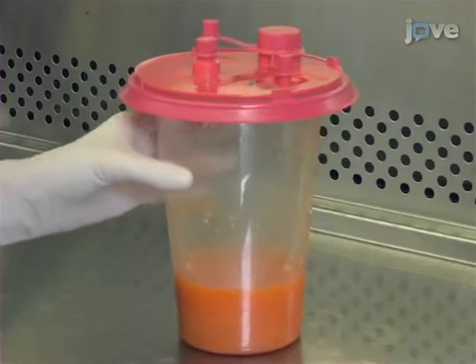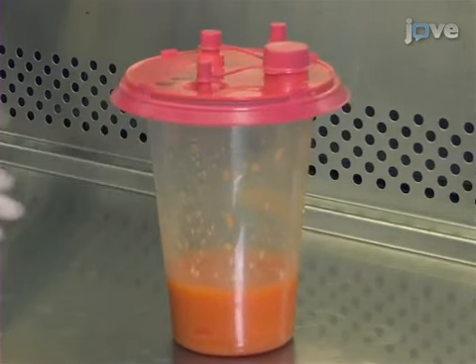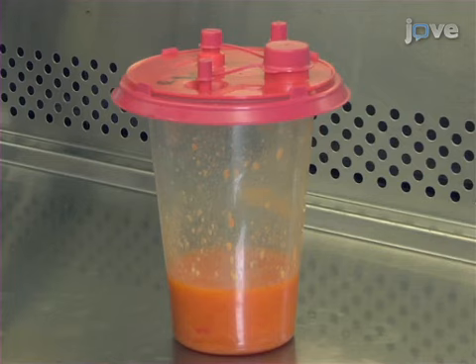Begin with 500 milliliters to 1 liter of tissue in a suction canister taken directly from the operating room. Immediately upon collection, begin the harvesting procedure. This will maximize the cell viability.